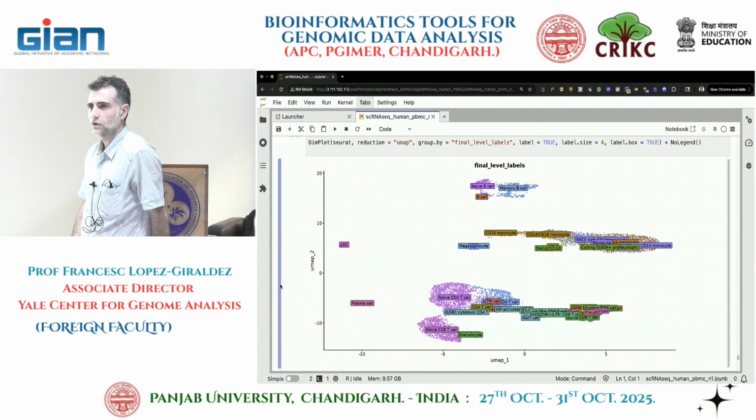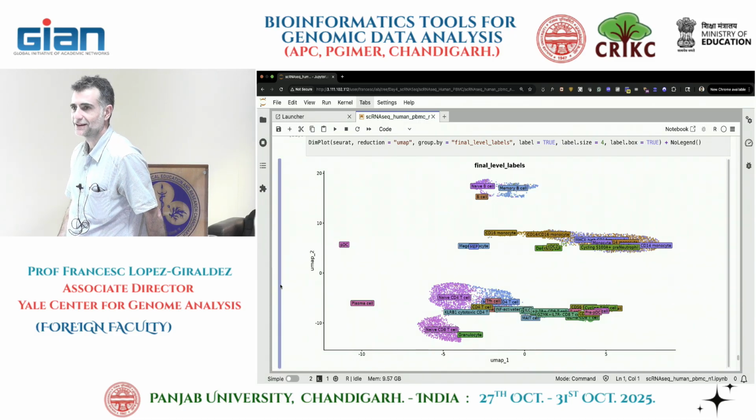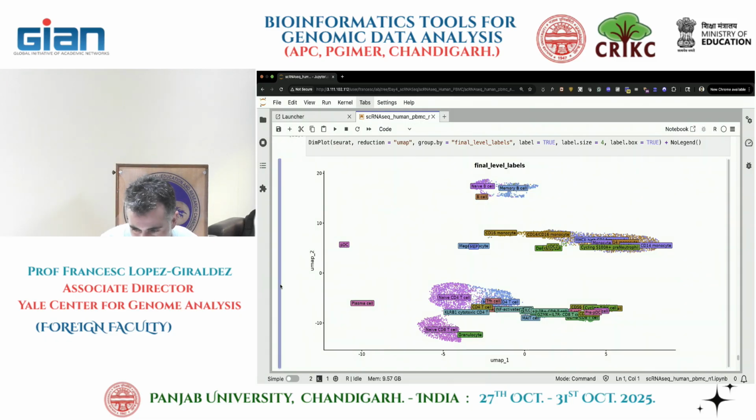And so also you got a megakaryocyte. Megakaryocyte is in the marrow. It's somewhere behind this label, right? So it is a megakaryocyte. Okay. So normally you should not see a megakaryocyte in the peripheral blood. So let's do.